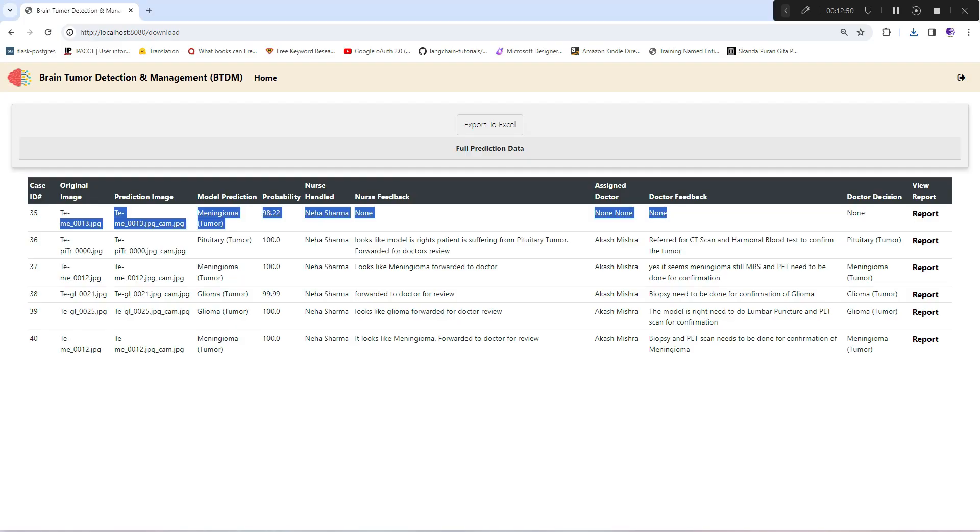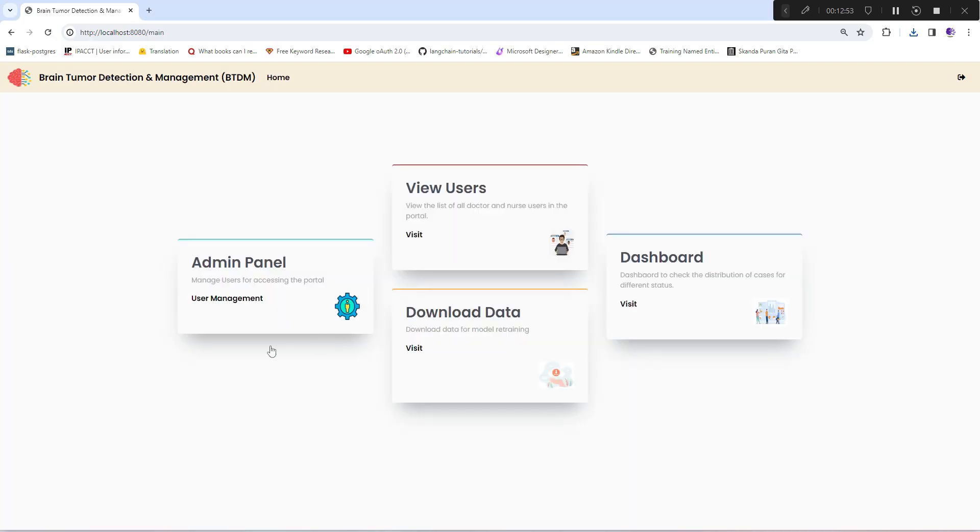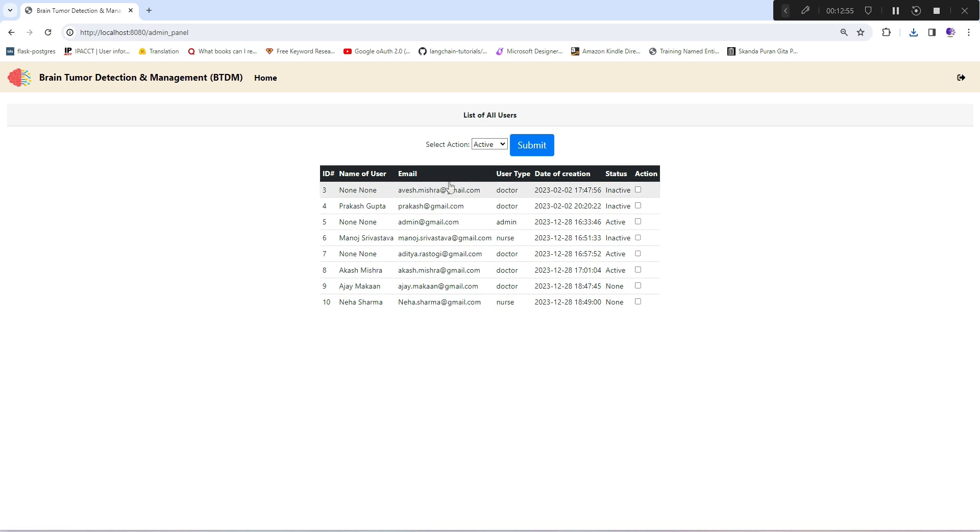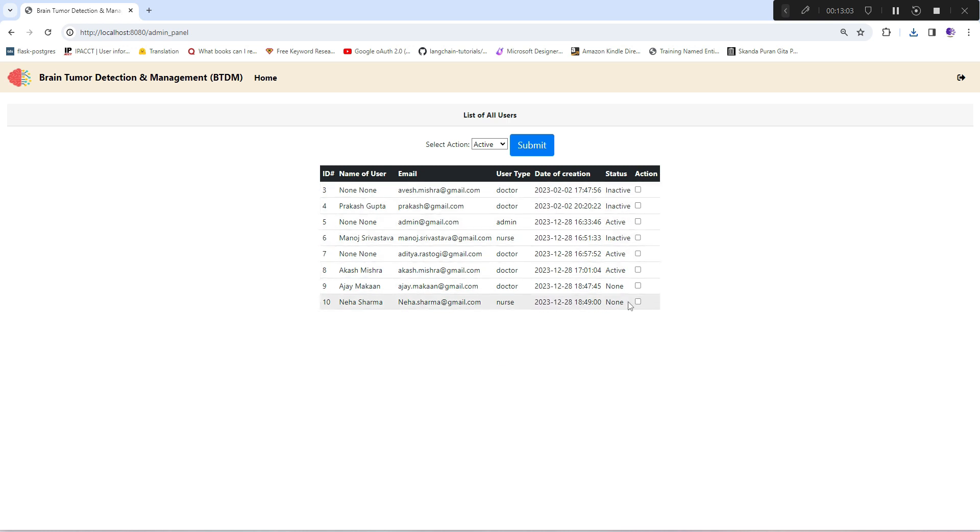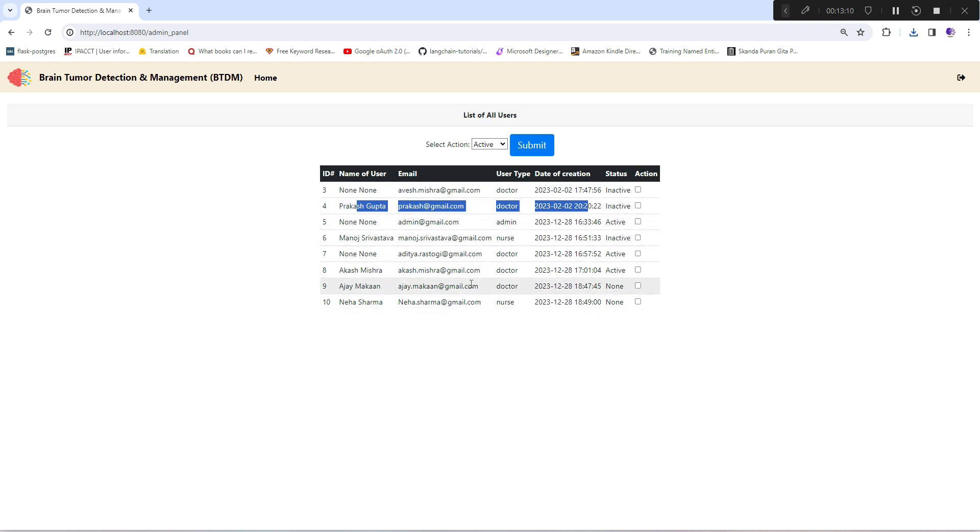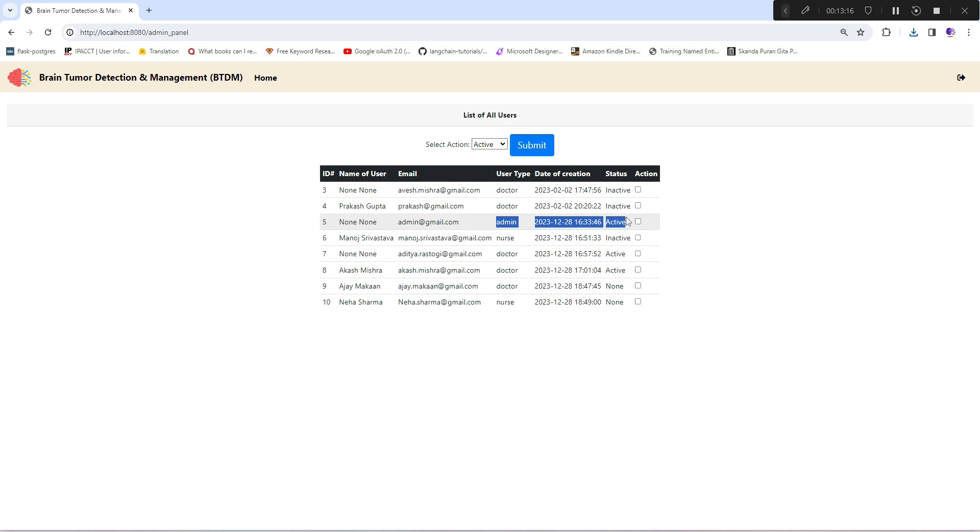One more section is admin panel. In this, the admin can handle users - he can make users inactive or active. If a doctor is not attached to this system anymore, he can make him inactive. This is the complete control of the user base including admin as well.